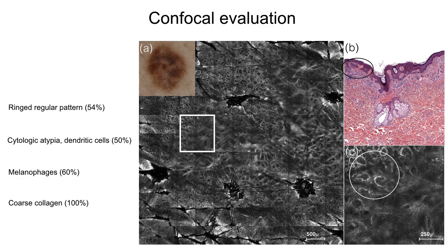Confocal microscopy can highlight the histopathological structures, especially those located at the surface. It is possible to see a ring pattern, some cytological atypia and dendritic cells, melanophages, and collagen alteration corresponding to coarse collagen fibers.